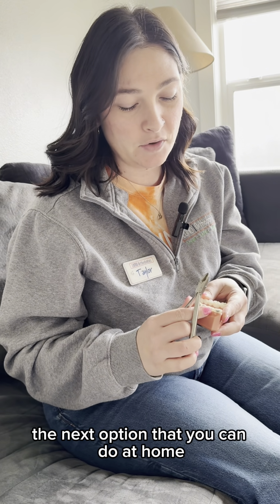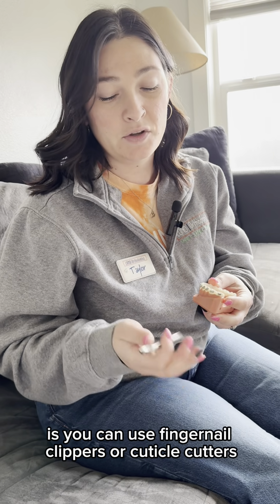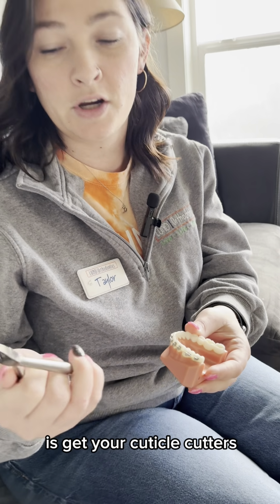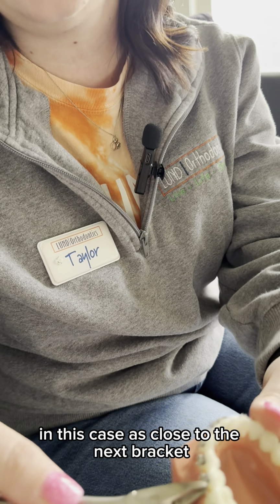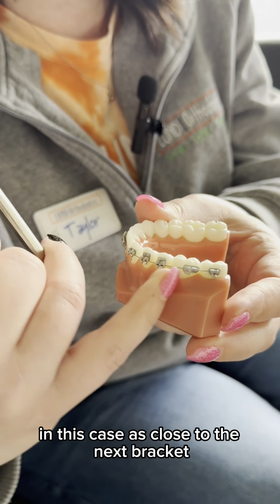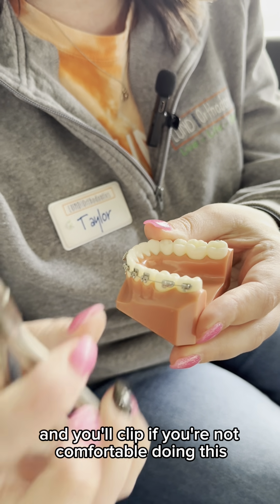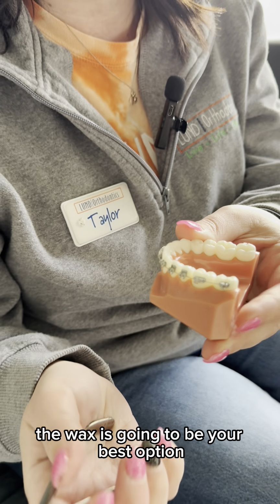The next option that you can do at home if this happens is you can use fingernail clippers or cuticle cutters. What you're going to want to do is get your cuticle cutters, in this case, as close to the next bracket that is not broken as you can, and you'll clip. If you're not comfortable doing this, the wax is going to be your best option.